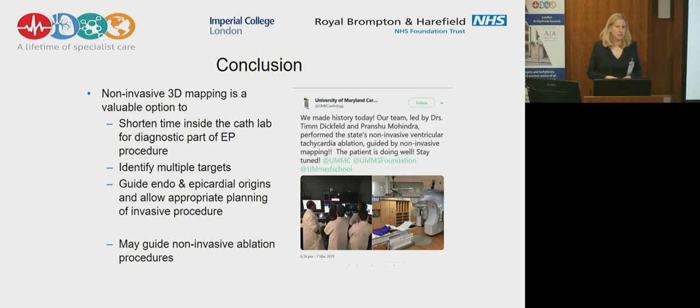I think it's a valuable tool. It's a new tool to do EP outside the EP labs. And that's great. I think it's great for patients with rare ectopy. It's great for patients with multiple targets. It allows us to plan endo and epicardial origins. I think that makes our procedure probably more focused, and we know what we're getting ourselves and the patients into.